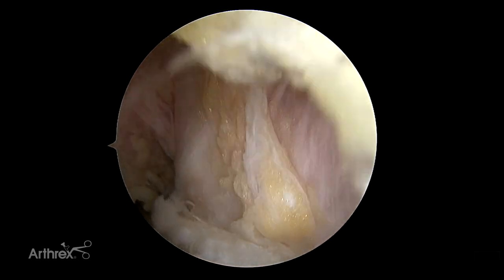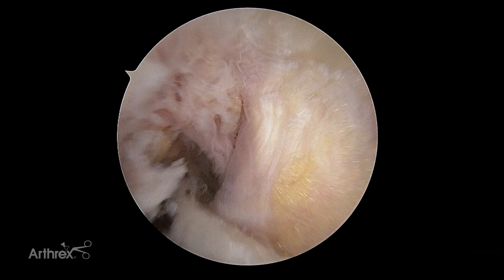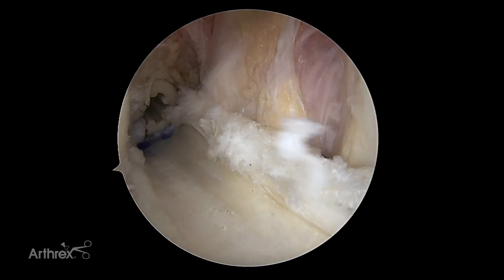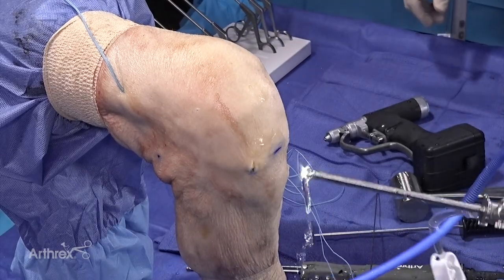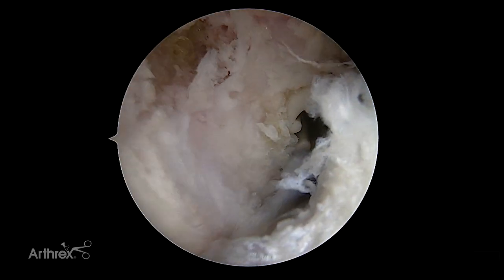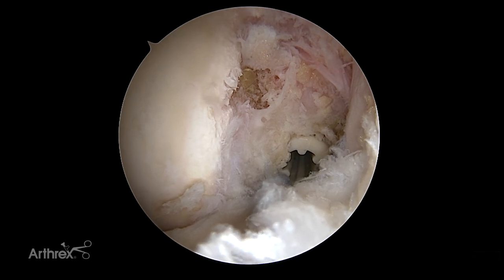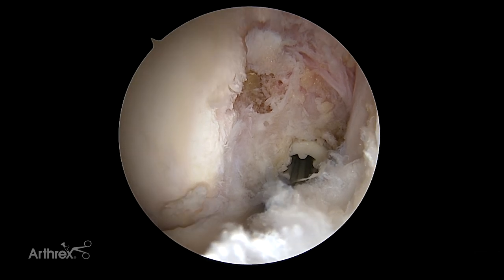As we cycle the knee, you can appreciate the fixation. We pull hard on the graft to confirm it's fixed, and in flexion and extension we appreciate the graft position — no evidence of impingement on the notch in full extension, no evidence of impingement on the PCL in deep flexion. Viewing from the medial portal confirms nice collinearity with the tendon interface. This is a reliable technique using a dilator and guide wire to reproducibly place an interference screw of any variety in a collinear fashion without a graft protector.